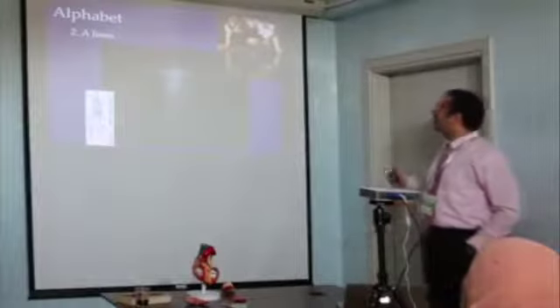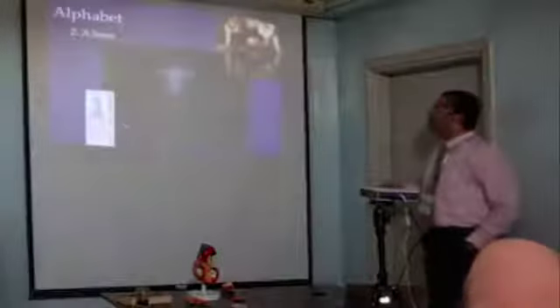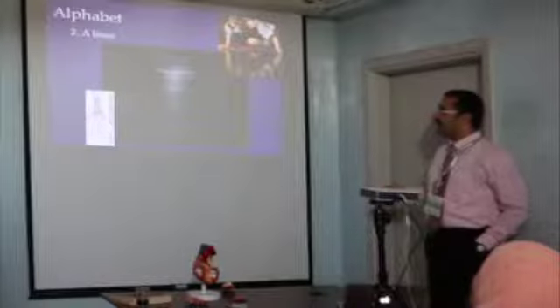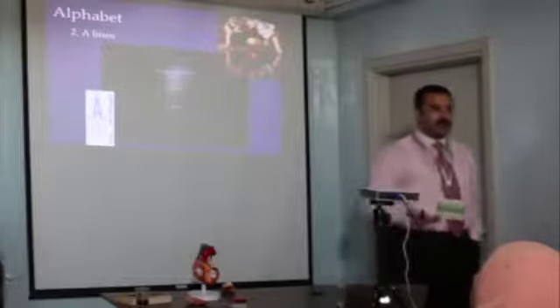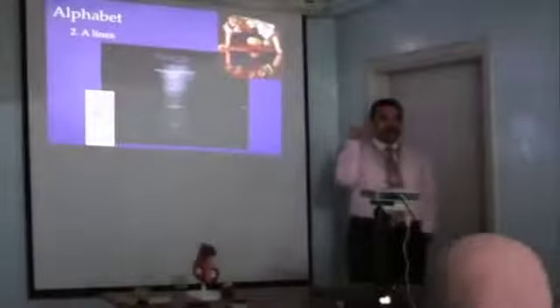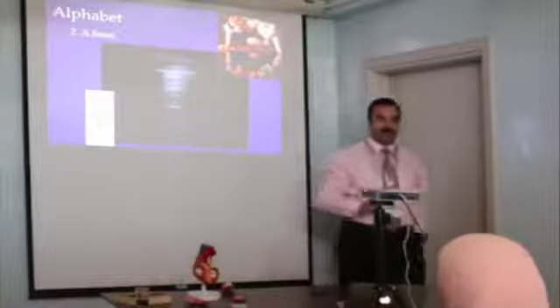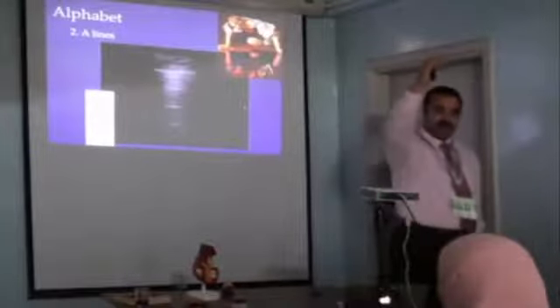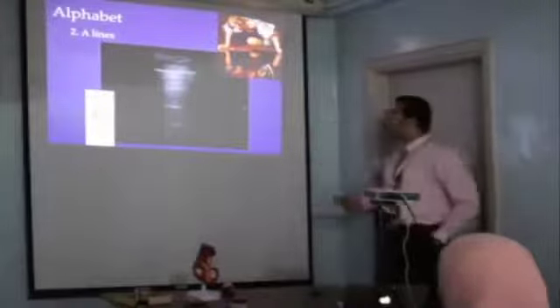A lines are just the mirror image of the pleura. When your probe sends ultrasound waves that travel through the lung tissue, what is echo? What's echo in Arabic? Do you remember in the past when a baby was laying with the echo? This is the echo. When I'm sending my sound waves, they come back to me in a repeated fashion, and this is what happens here.